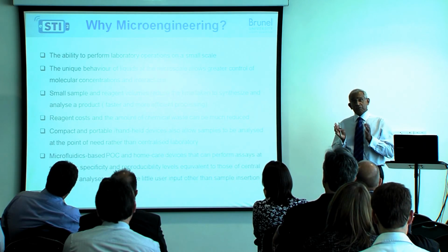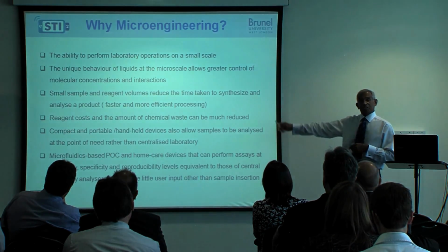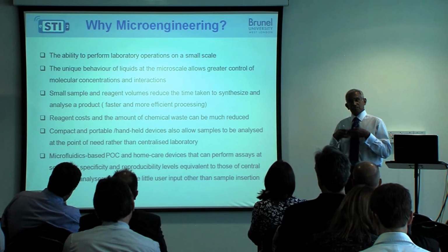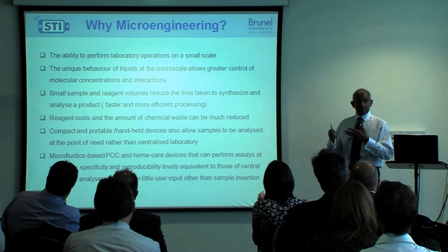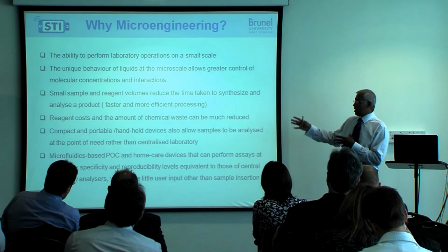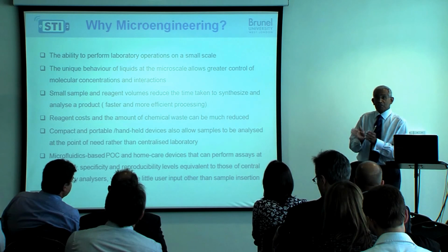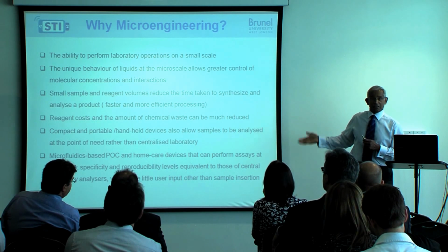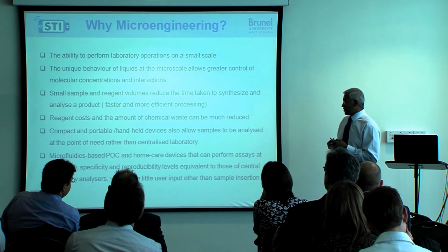Now, those of you who are in this sort of business would know that at every conference you go to, you will see a slide like this, the rationale for doing this kind of microfluidic-related work: why we need small quantities and fast response, and also point-of-need measurements. These are all standard terminology you will come across from time to time. So just to remind you why we do the work and why microfluidic-based systems are good, that's the reason to show this slide. It's not only microfluidics, there are other components that come with it. One part of that, of course, is the electronics to control the process of moving a biological molecule from one location to another.